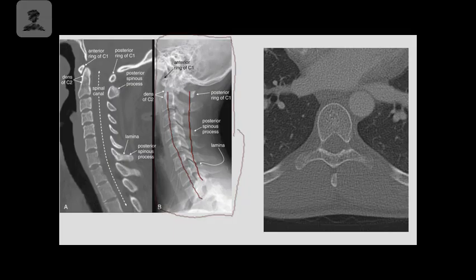I have an axial view over here. With this patient, you can see we cone down a little bit just to look at the T-spine. One thing I will say is I know for sure that this patient is going to have more of a bone detail on this side. The reason I say that is because it's very speckled, a little bit more noisy. But if you look, the bone is not overly bright. We can see some bright areas around the outside, but the internal portion has a lot of shades of gray. So if there was a fracture inside that vertebral body or the spinous process, the lamina, transverse process, we would be able to identify those very easily. Definitely something that we look at pretty frequently.